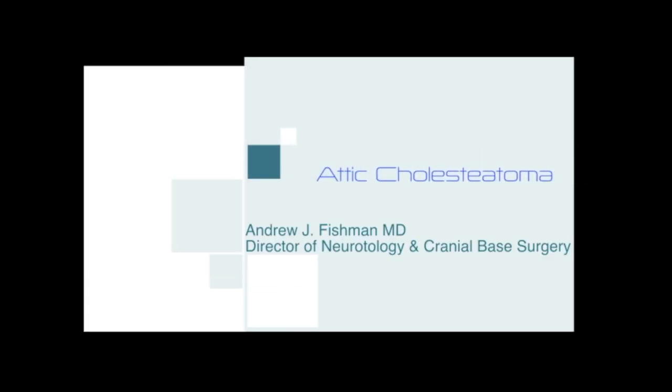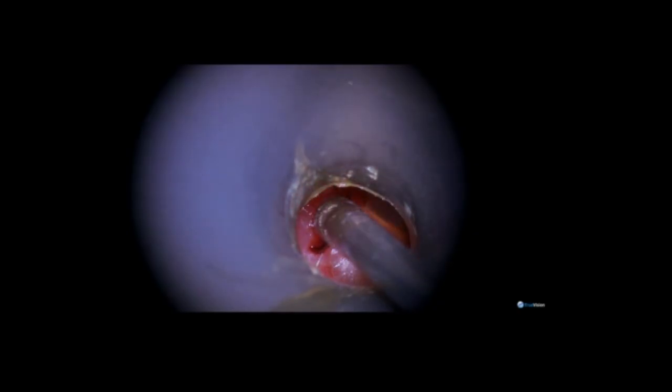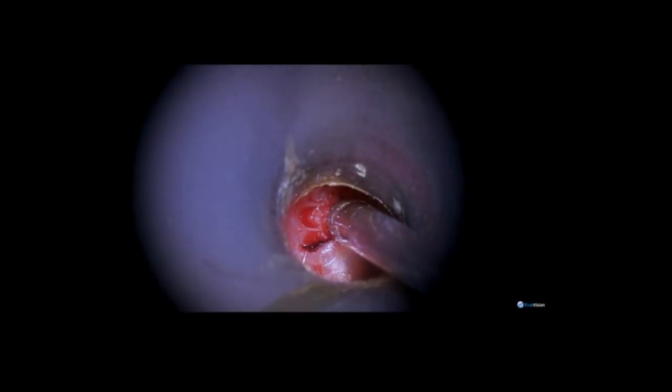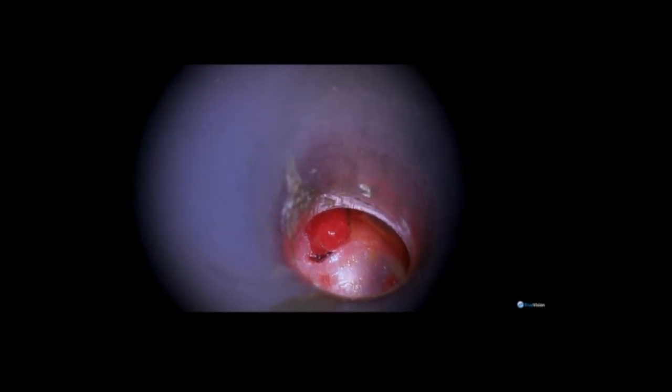In this video, I'm going to demonstrate a fairly standard approach for the removal of an attic cholesteatoma. When performing ear microscopy, it is very important to examine the upper attic region. Here you can see a polyp, and the polyp generally represents granulation or inflammatory tissue emitting from the neck or the opening of the sac of the cholesteatoma.